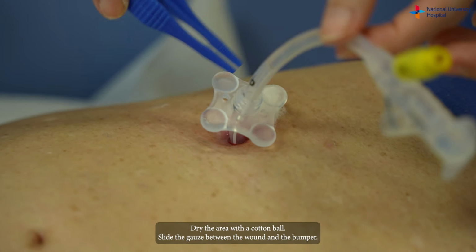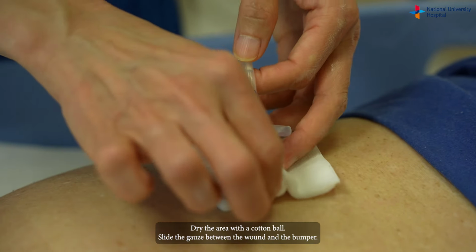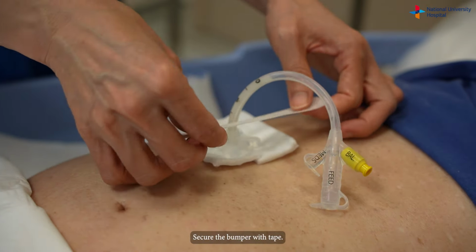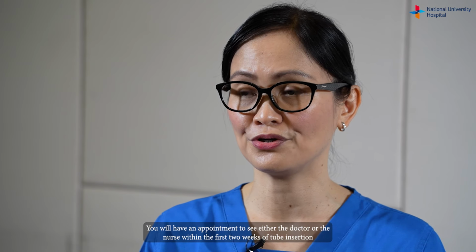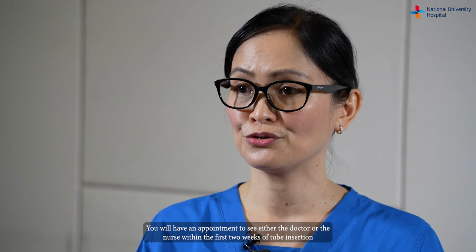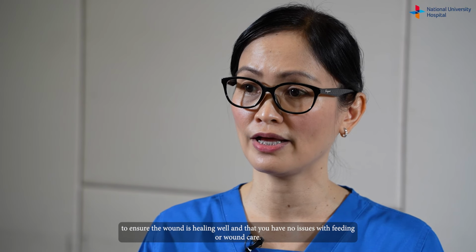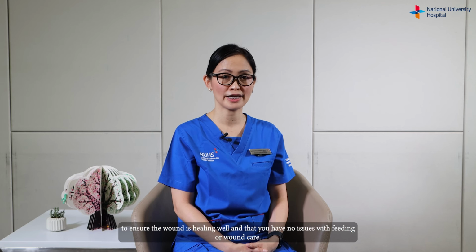Clean the wound using a cotton ball with saline and gently remove any discharge or crust. Dry the area with a cotton ball. Slide a gauze between the wound and the bumper. Secure the bumper with a tape. You will have an appointment to see either the doctor or the nurse within the first 2 weeks of the tube insertion to ensure the wound is healing well and you have no issues with feeding or wound care.